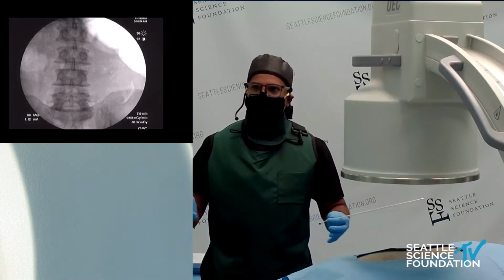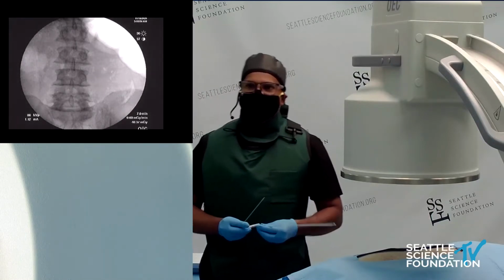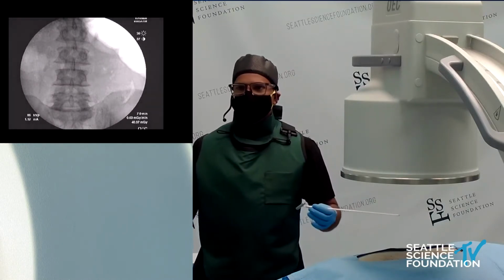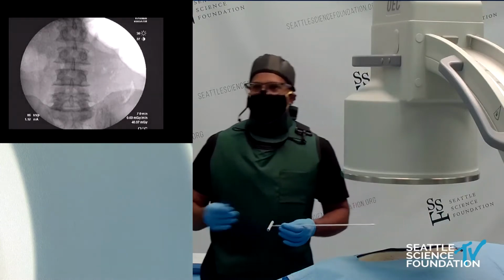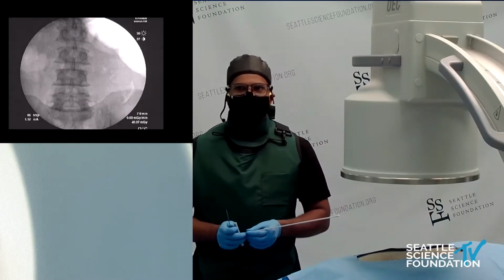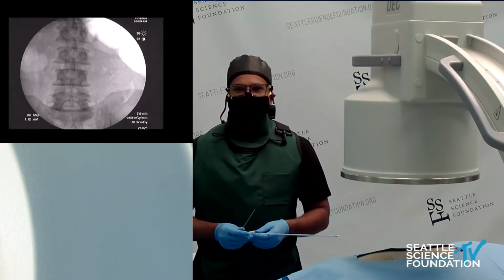So we have a cadaver here, and we're just going to pretend that this patient has a history of a total knee arthroplasty on the right side and developed some CRPS-like symptoms, some sympathetically maintained symptoms such as allodynia, redness, and a little bit of swelling. The surgeons evaluated for infection. It was negative. Imaging looked quite good from their perspective, and the patient is really suffering and is 9 months out from their surgery.